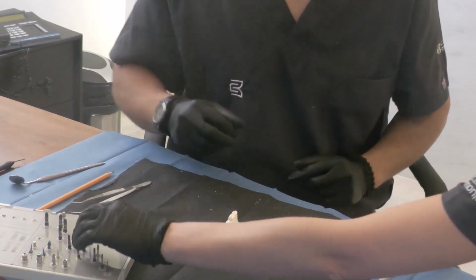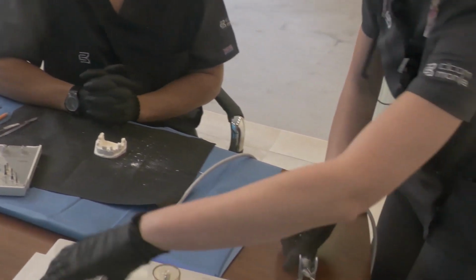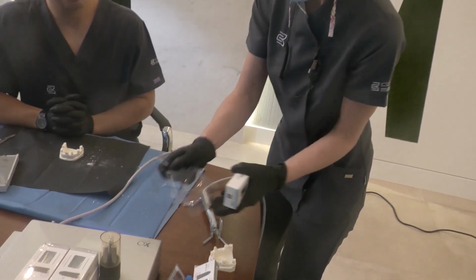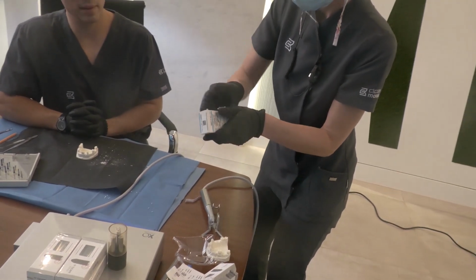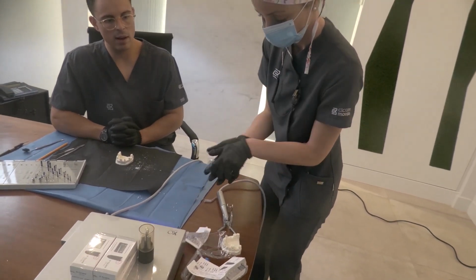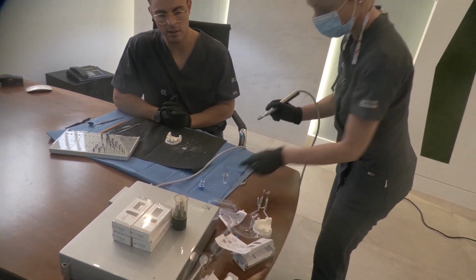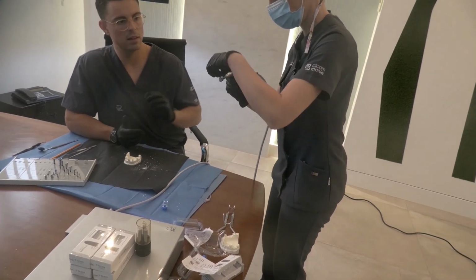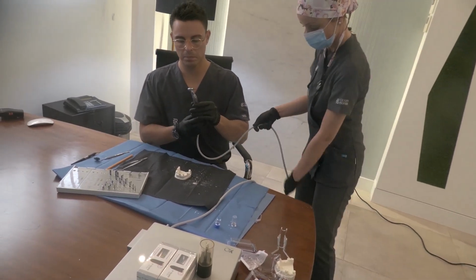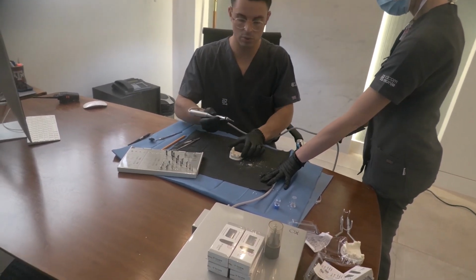Okay, so now we're going to be placing the implant. Now it's going to be preparing the transfer. And again, the Ticare Inhex dental implant will be extracted from the case. By the way, this implant surface, the Inhex implant surface, in terms of the topographic characteristics, has shown to have high bone to implant contact, which again will be assisting in the osseointegration process.